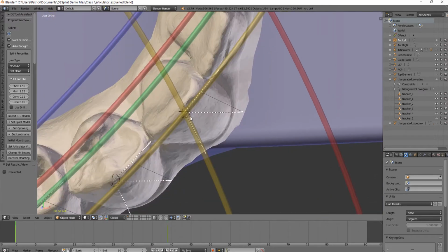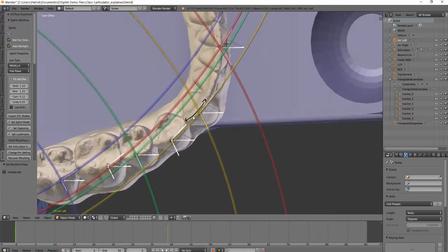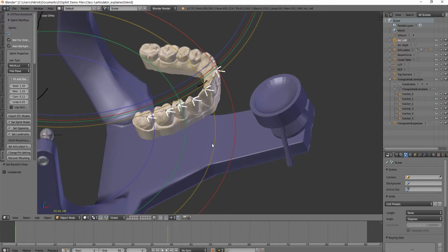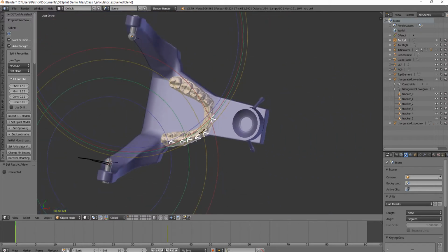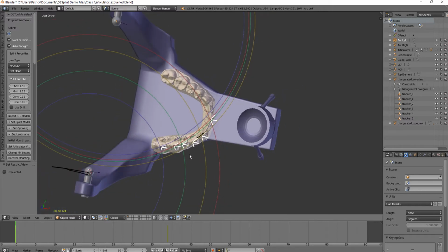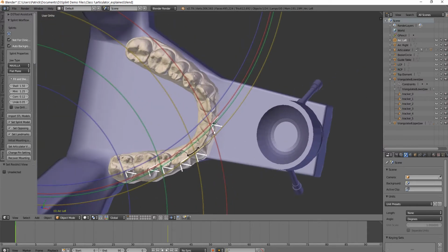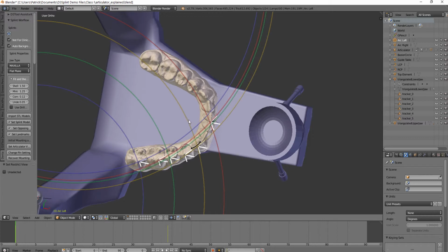And then finally, here's the canine, which I think it's interesting that, in the canine, the contralateral excursion ends up being almost perfectly aligned with the mesiodistal of the tooth. And another little interesting point is if you count the color, it's blue, green, yellow, red, but coming from the other side, they're actually out of order in the radius from the tooth cusp to the condyle. So I just find that very interesting. It's like the incisor and the premolar are about the same radius away from the contralateral side, whereas when you're moving from the ipsilateral side, they're much more evenly spaced.